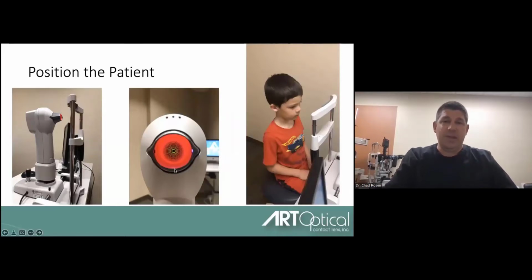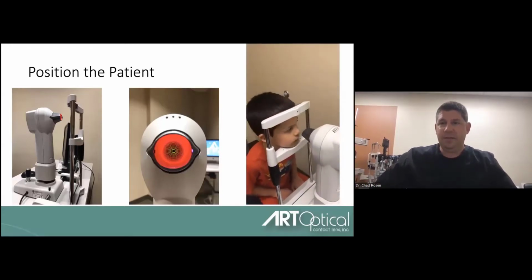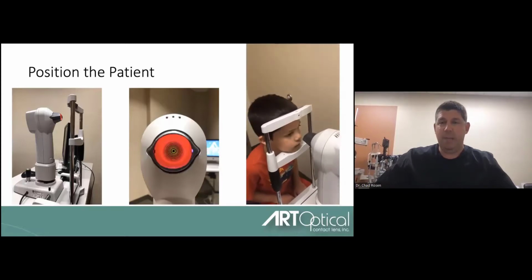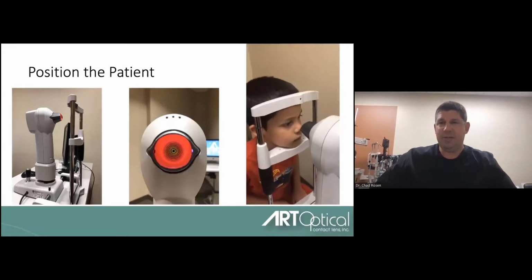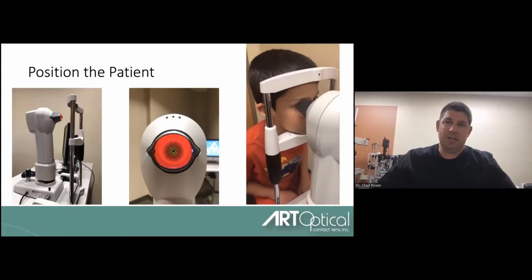This is the view that the patient has as they look down the center of the tube. That's what they see. And then our assistant here, Andrew, who's a 6-year-old, is going to show us how to get into position. And you'll see as he goes in there, I have him turn his head to the left. He goes a little too far at first. I don't need him to turn that much. So he turns back just slightly, just a slight tilt. That lets me get in really close because that's where I need to be able to get the image.